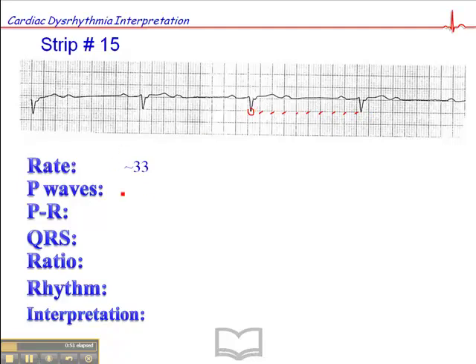So heart rate's about 33 beats per minute, that's pretty accurate. P waves are definitely present and upright. The PR interval is 0.28 seconds. It's prolonged.